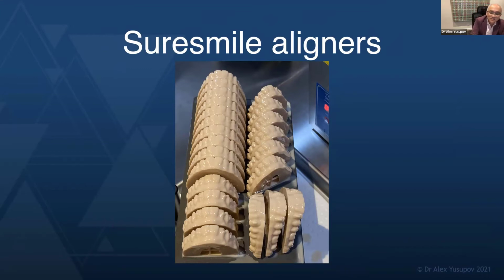But this is becoming an increasing part of our practice. We're doing more and more in-house aligners. And the ability to produce just the number of aligners that you need at the time without committing yourself to the whole 33 or 40 aligners. And the fact that I don't have to restrict myself just to less than 10 aligner cases because of my printing capacity means we can do full treatment cases, and we do today using aligners.